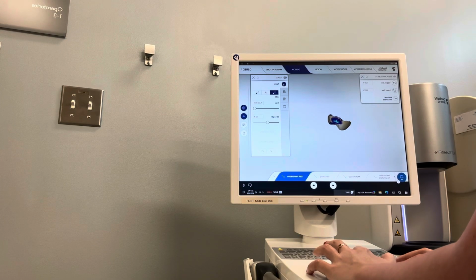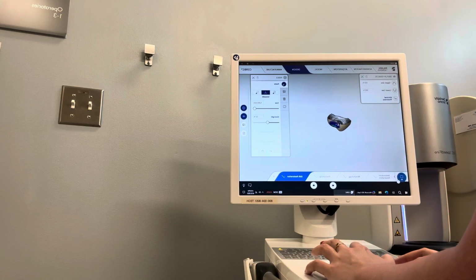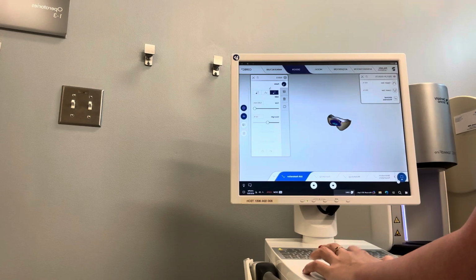So like I said, in the top left, looking at the screen where I'm messing right now, is the smooth, add and subtract material tool. There's also a little tab in that same white drop down box where you can change the anatomy of the crown, like bring it up, bring it down to fit the models. And then in the top right white box is the upper jaw and lower jaw selections, and that just turns it on and turns it off.